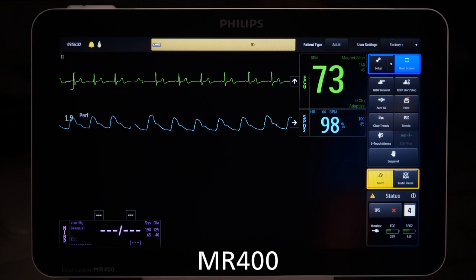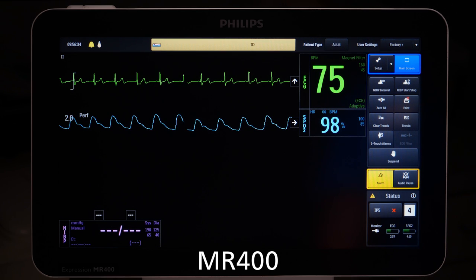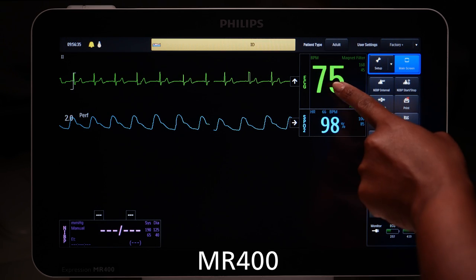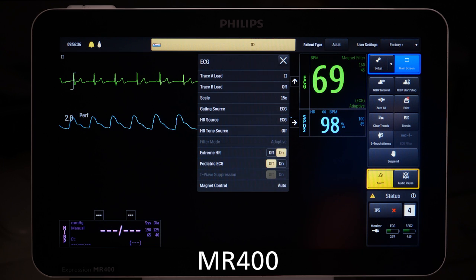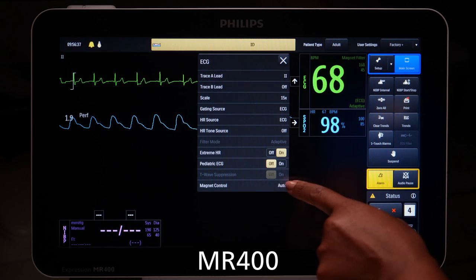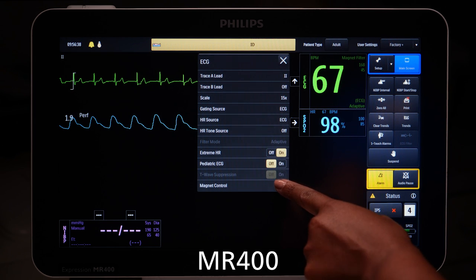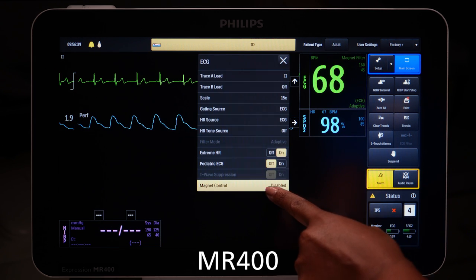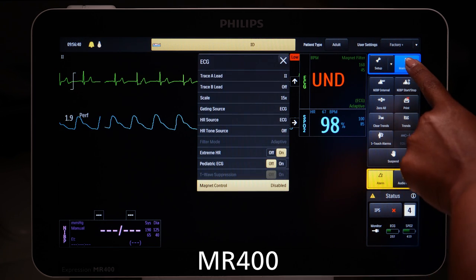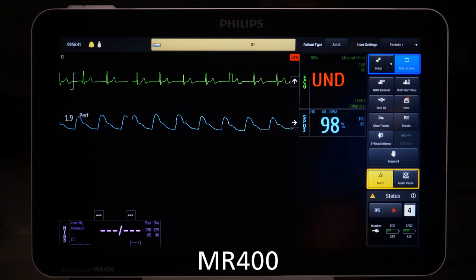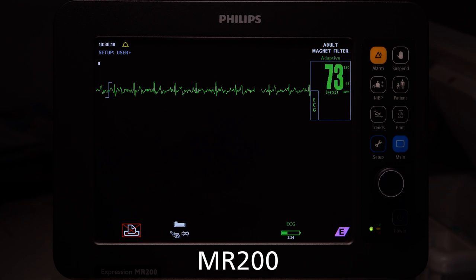To use the monitor filtering, you will need to disable Magnet Control. To disable Magnet Control on the MR400, open the ECG menu, find Magnet Control and set to Disable. The Interoperability mode will be disabled.